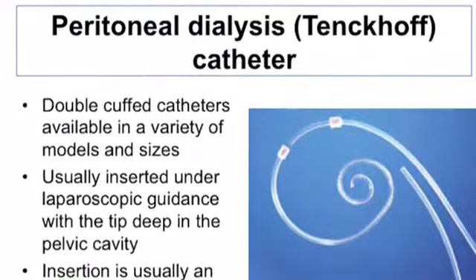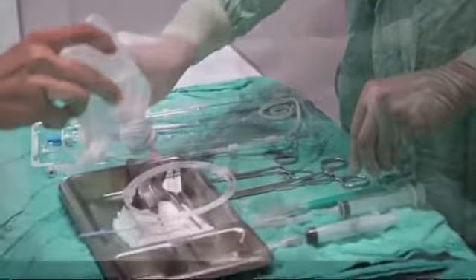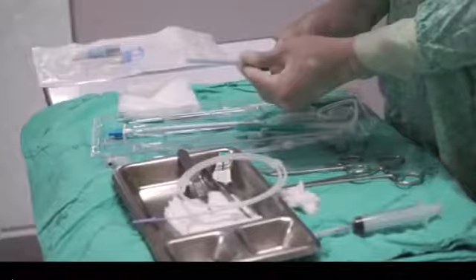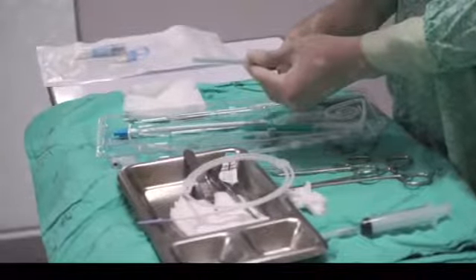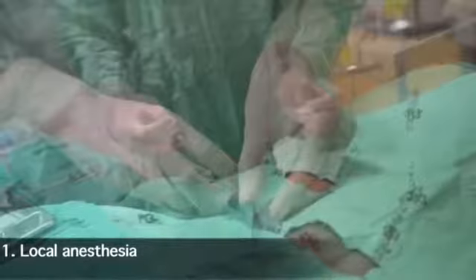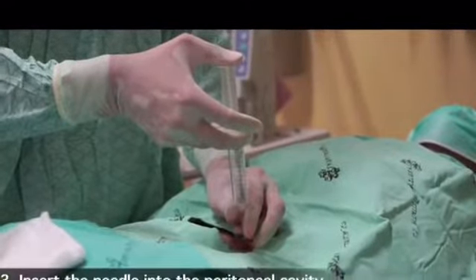Pre-operative preparation for peritoneal catheter insertion. Ensure that the patient requires the catheter and that he or she understands the principles of catheter care. Obtain consent for the procedure. The patient should bathe using an antiseptic soap. Discuss with the patient where he or she would like the exit site placed. Avoid the belt line of trousers. It should be easily accessible for the patient to care for the exit site. The exit site should not be under an abdominal overhang in obese patients.